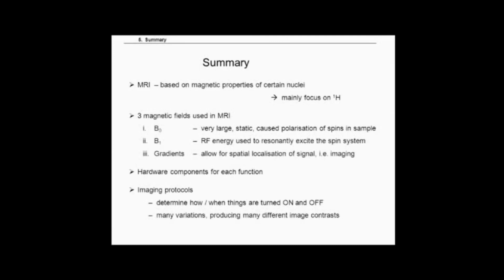We talked about the different hardware components which generate each of these functions, and we talked very briefly about the imaging protocols, which determine the timing diagrams of when things are applied and turned on and off, and there are many different types producing different image contrasts.